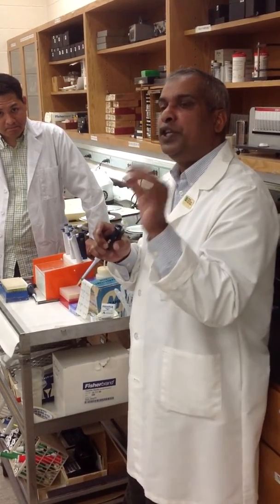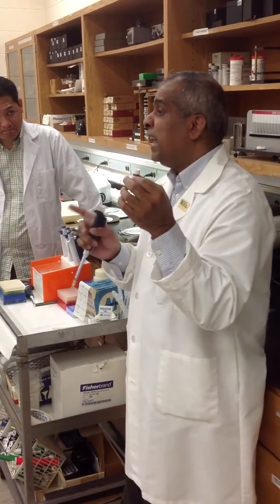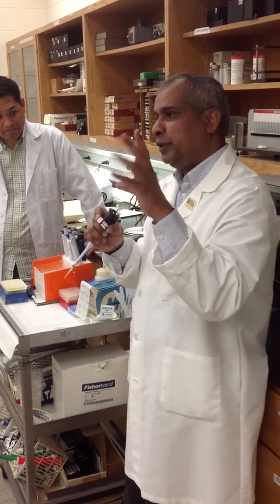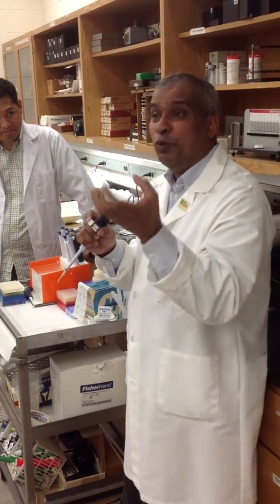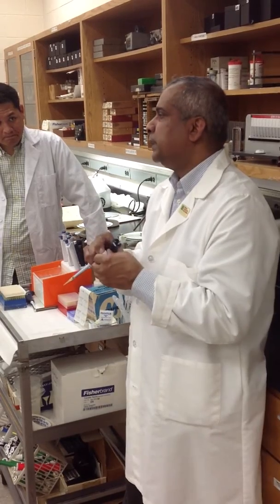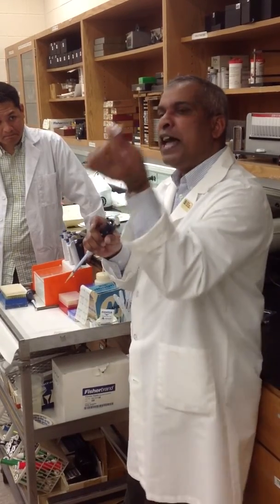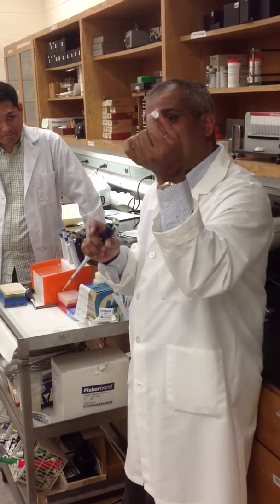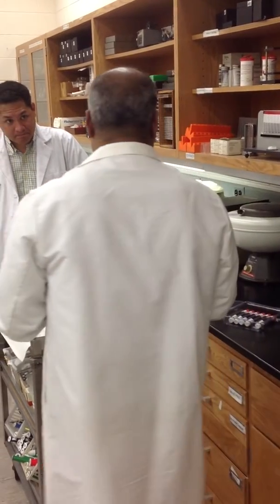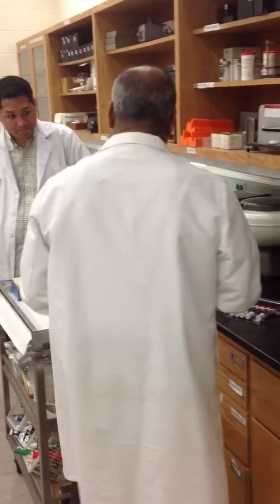The white cells in here are actually taken from a different animal when they use it. So it's much larger than a human white cell. So it's easy to count and differentiate. And so this might not be human, it might be from some animal, but it's comparable for the counting. And the machine recognizes it also.